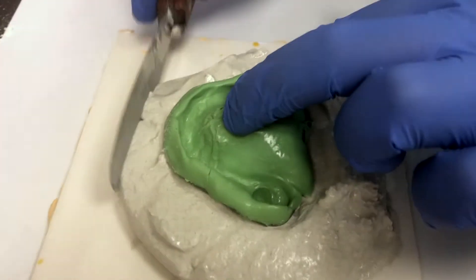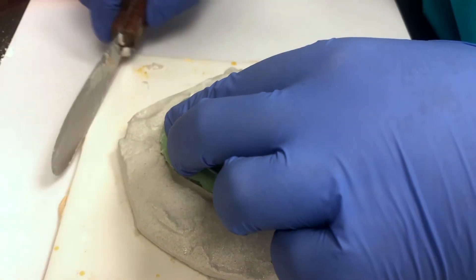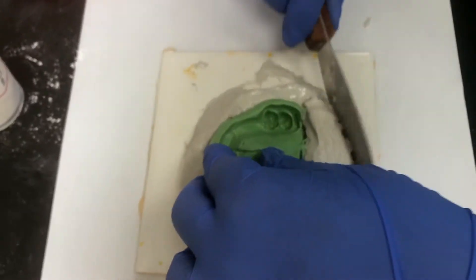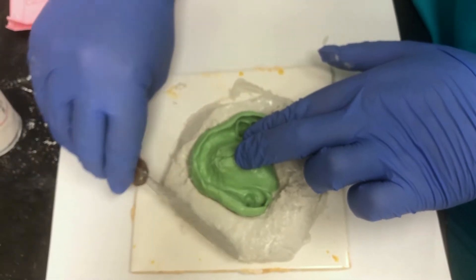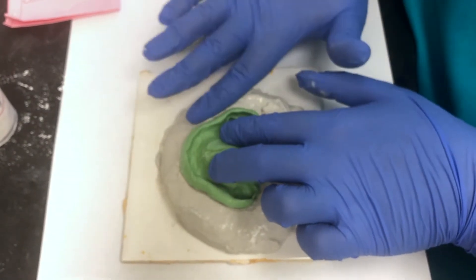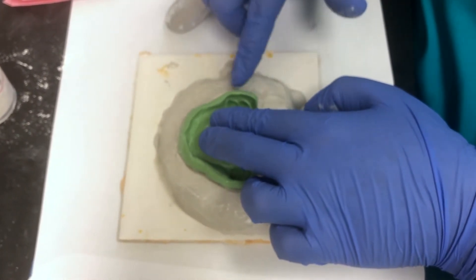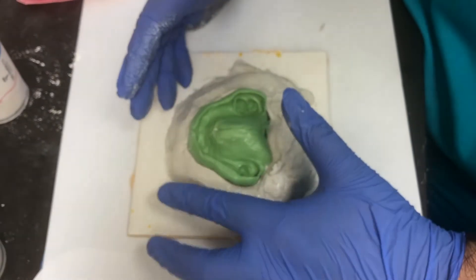Once you get it nice and tight around your impression, make sure there are no undercuts. I'm kind of pushing it tightly against the impression because I do not want any MicroStone to go into any void areas. And in the end, I'll trim all this excess off.